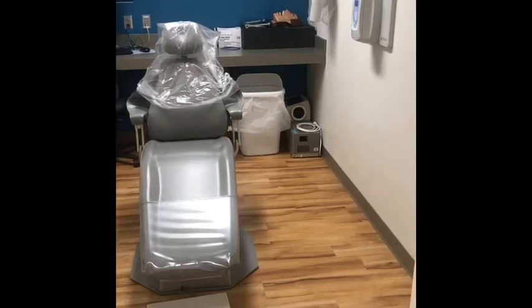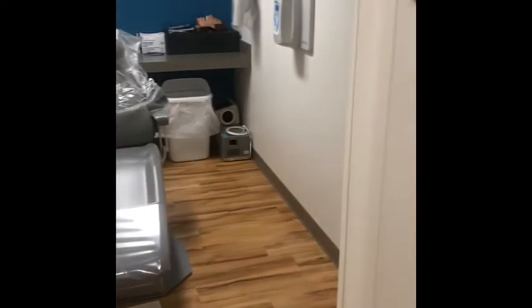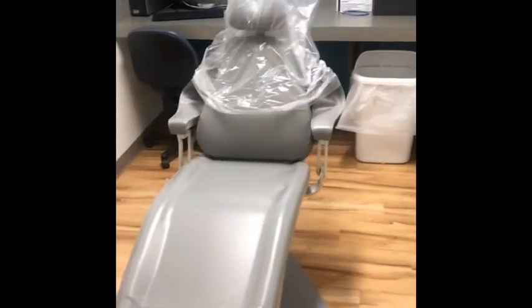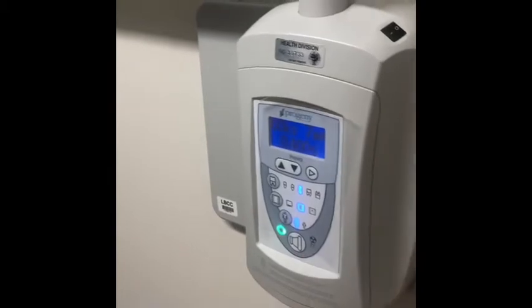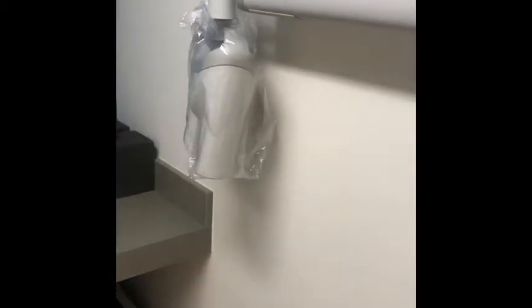For our treatment room preparation for a radiology patient, we need to make sure that we do have a few barriers in place prior to bringing your patient back. First is making sure that our exposure button has a piece of tape over that. Our chair and headrest cover are covered. We have a piece of tape on the exposure panel. And then last is a barrier over the tube head.